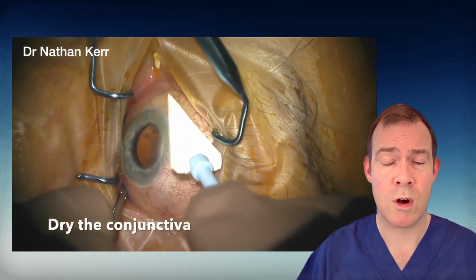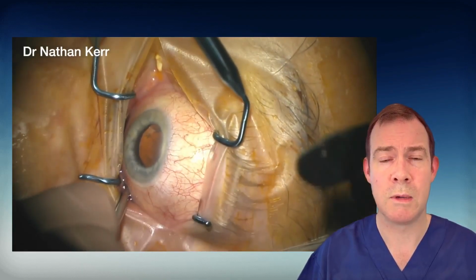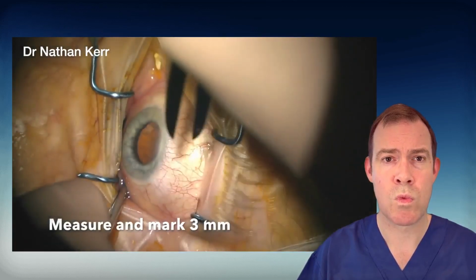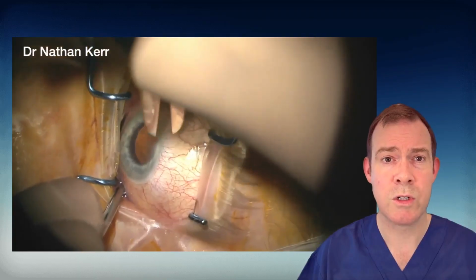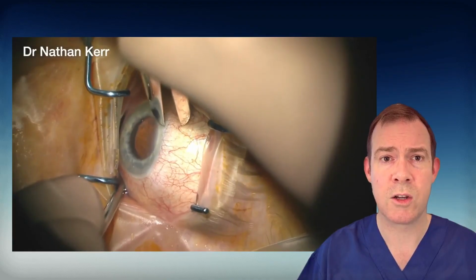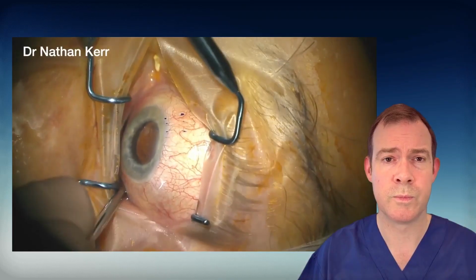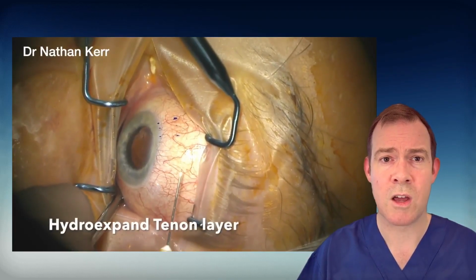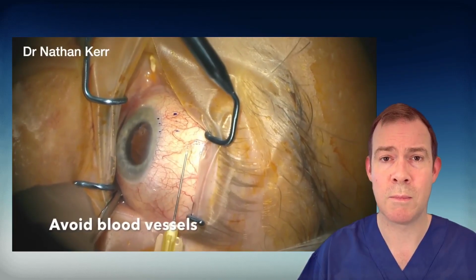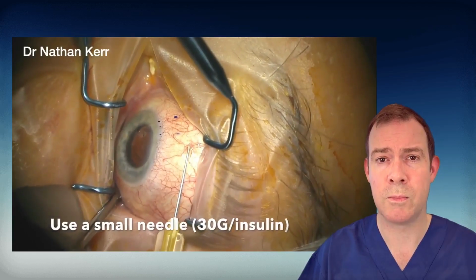We now need to dry the conjunctiva before we use calipers to mark 3 millimeters from the limbus. We're inspecting the target quadrant, which is typically supranasal, ensuring that the conjunctiva in this zone is healthy and mobile. The next step is to hydroexpand the Tenon layer. We want to minimize bleeding by avoiding blood vessels, and using a small 30 gauge needle can be helpful.